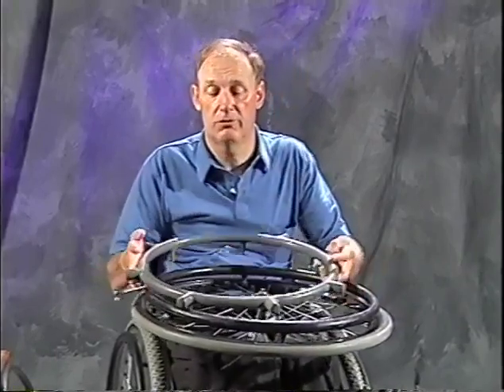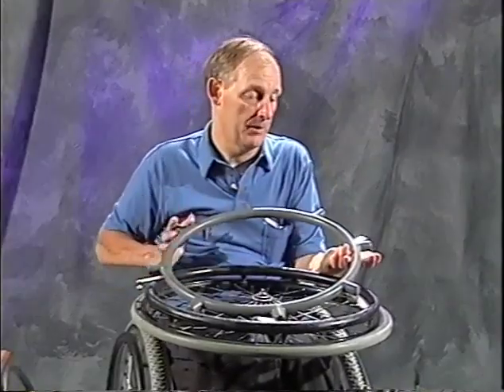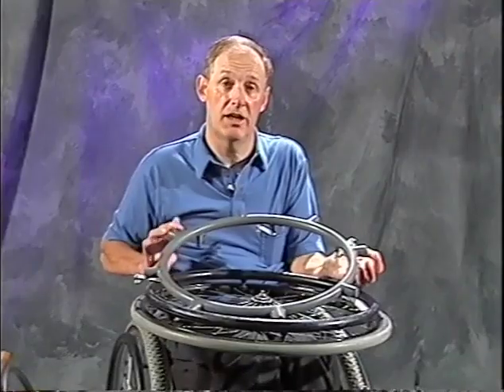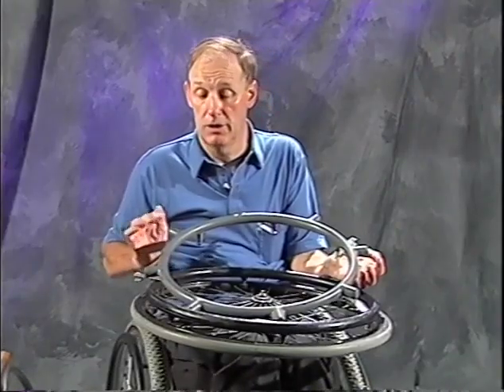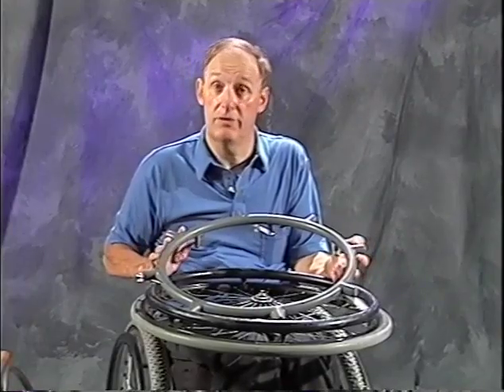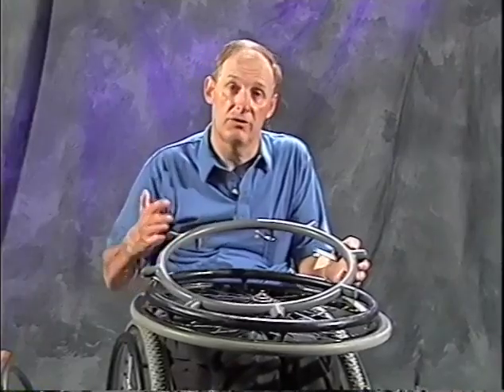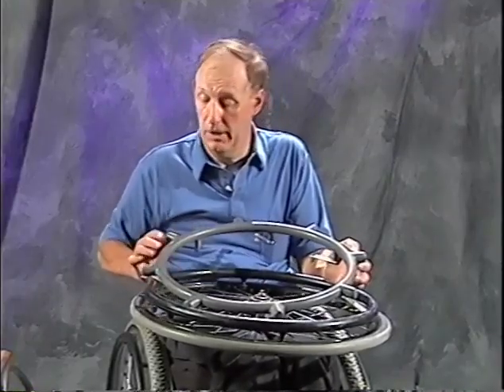And when it comes to the projection hand rims, there are 8, 10, and 12 lug hand rims. I would strongly suggest that you try even a 12 if you can find them. I think it just makes the placement of your hand a little bit easier. The spaces are a little bit shorter, so if you miss, you're not missing for such a long distance.